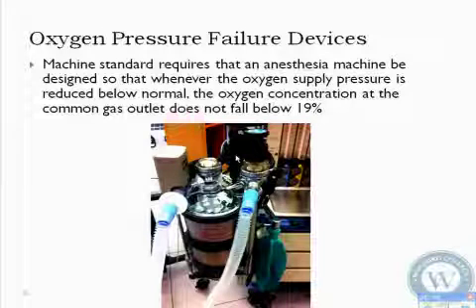Okay, oxygen pressure failure devices. I found this kind of interesting as I was reading. The primary book I use for this equipment lecture is Dr. Dorsch's book, because it's imperative that we teach this, but there's no class geared towards it in any school where you have just an equipment lecture. So we don't have an equipment textbook, and you fit this type of stuff in. Our physics book, of course, doesn't cover it. It talks about pressure, it talks about flow, it'll talk about your breathing systems, but it doesn't talk about the components of this. Nothing really does.